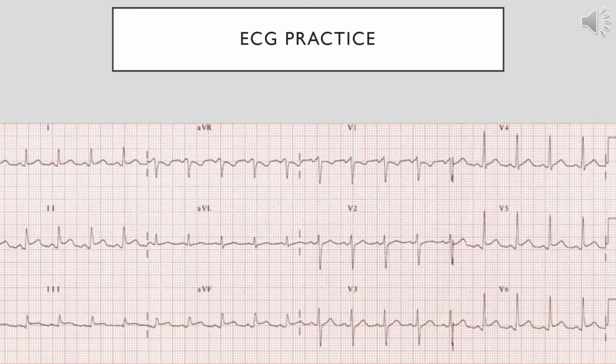Moving on to evaluation of other factors. This doesn't look like the patient's in cardiac arrest, so that's good. We don't have to shock or anything crazy like that. But what about some axis changes? Do we see any axis changes on this EKG? We have positive amplitude in leads 1, 2, and aVF, so it looks like a normal axis. What about the ST segment? We're looking at ST, and we see a noticeable ST segment change in leads 1, 2, and 3.